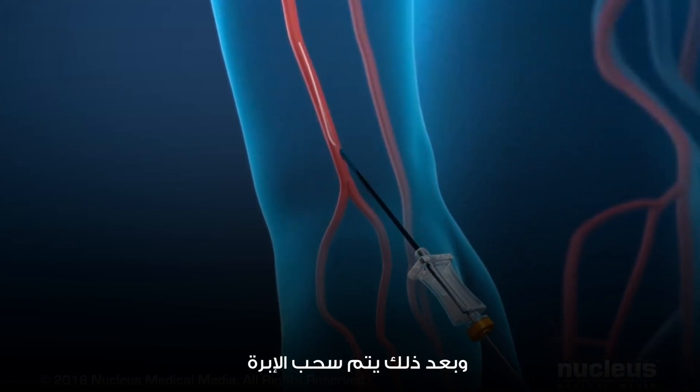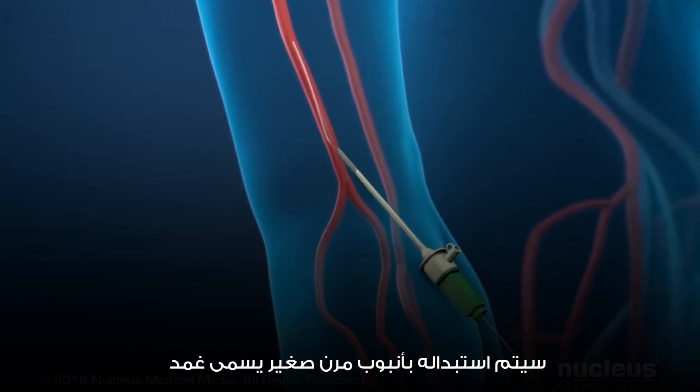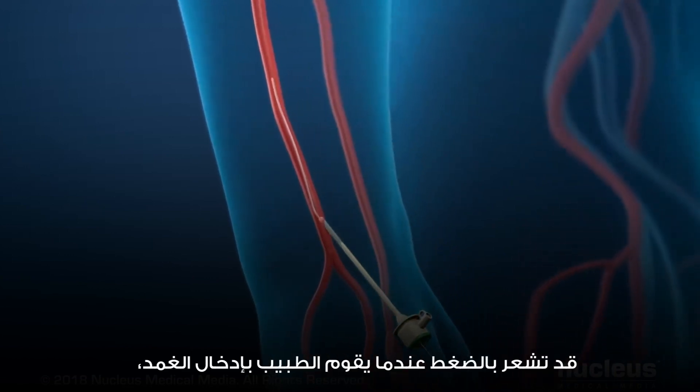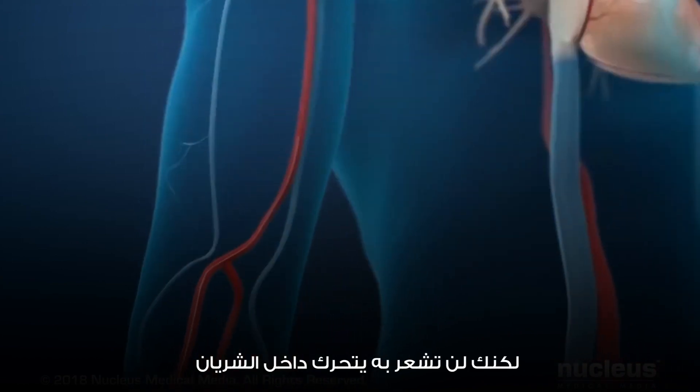Then the needle will be withdrawn and exchanged for a small flexible tube called a sheath, which permits access into your artery. You may feel pressure when the doctor inserts the sheath, but you will not feel it moving inside your artery.